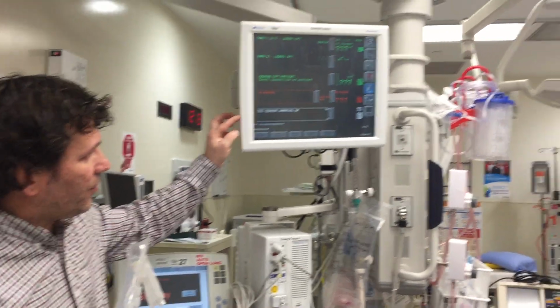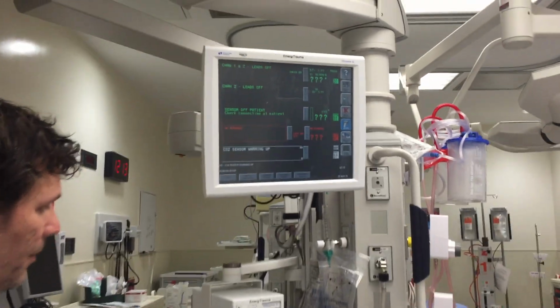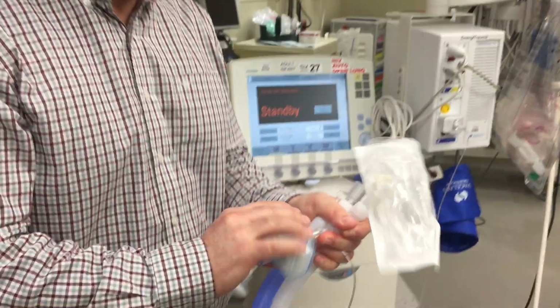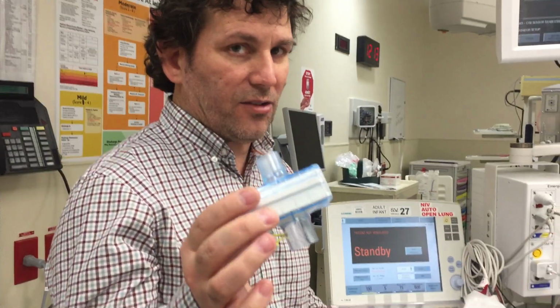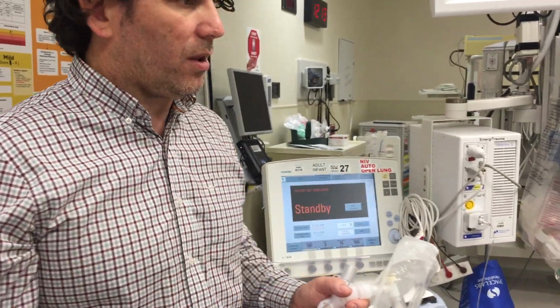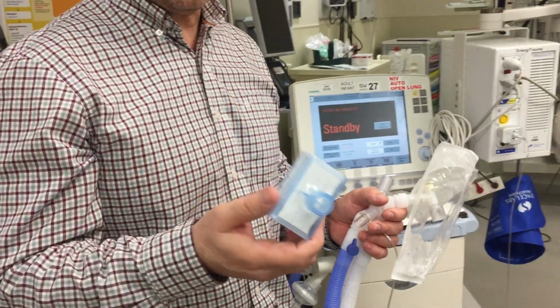So we can see the end-tidal CO2 is up on the screen. We know that's warming up and it's going. The other part of the circuit that we are concerned about is this here, often called a HEPA filter, but we call it an HME in our respiratory world because we have dry gases coming through the ventilator and we want to make sure that they're humidified.